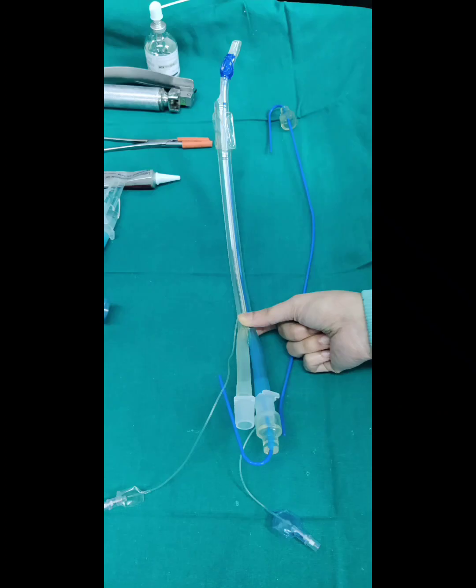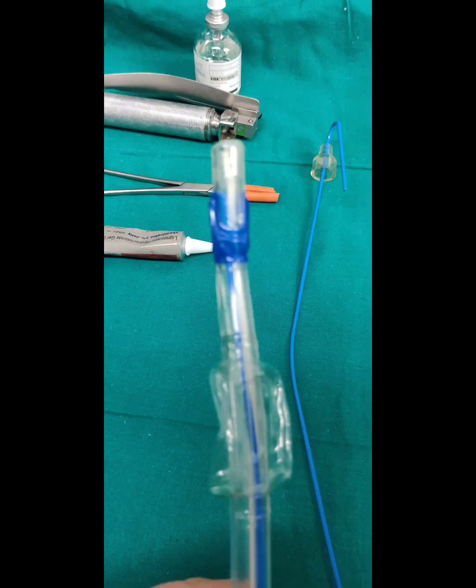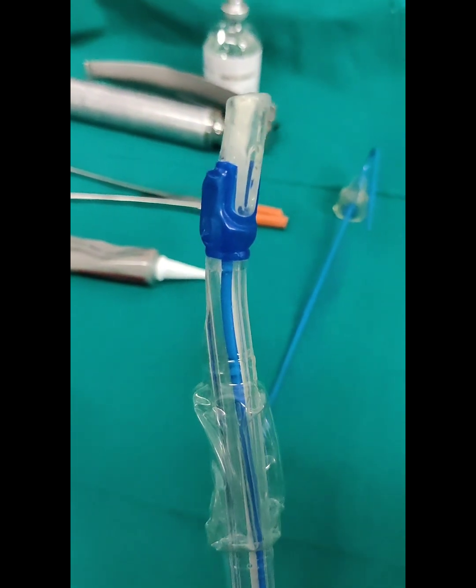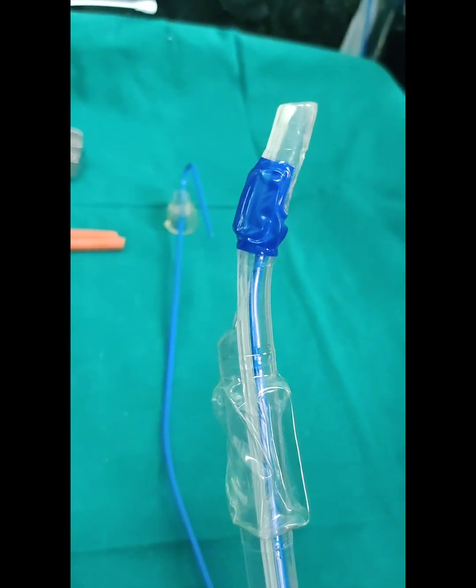A double lumen tube has two endotracheal tubes bound together along the length and is made of PVC. On cross section, each of the two tubes is D-shaped. The distally shorter tube stays in the trachea, and the distally longer tube is designed to fit in either the right or left main stem bronchus. Depending on which bronchus the distal tube fits, the DLT is labelled either right-sided or left-sided.